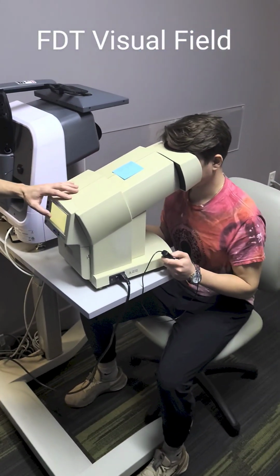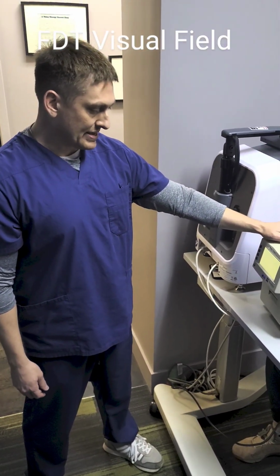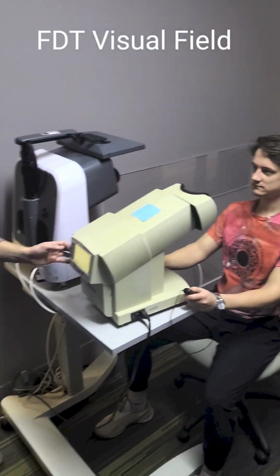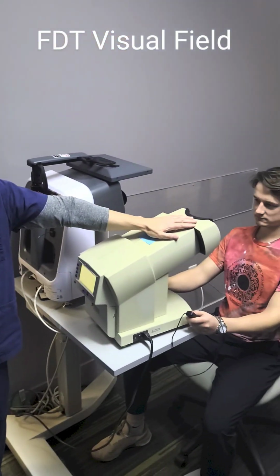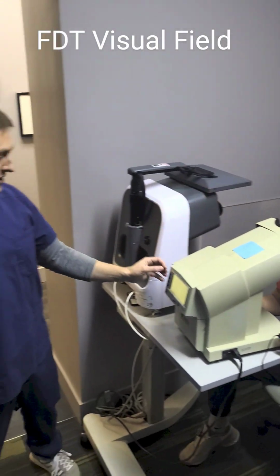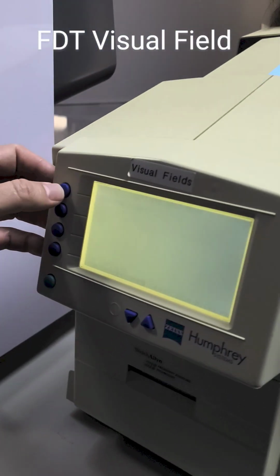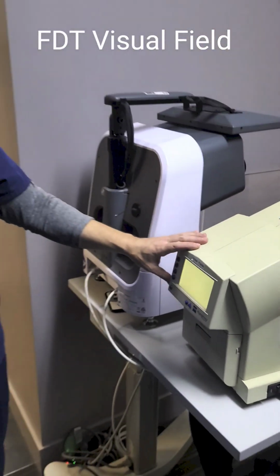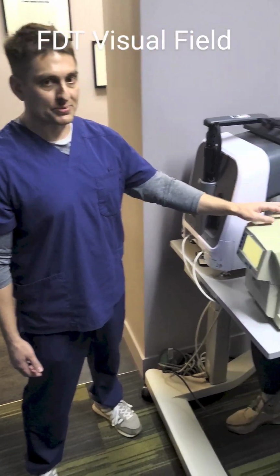So this test is about 92% done. A few more seconds and we can go ahead and note we're going to test the left eye now. To test the left eye, you're going to want to slide the viewfinder over to your left as the examiner. Hit the button that says Screening C20-1, which is our standard test here, and the machine will begin to calibrate automatically. Once it's done so, the test will begin.